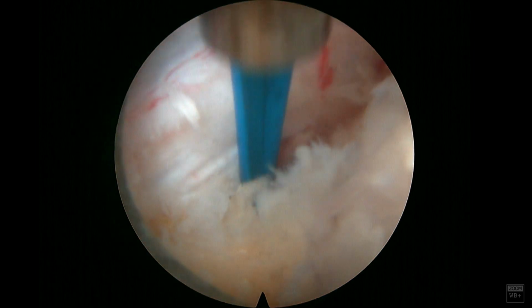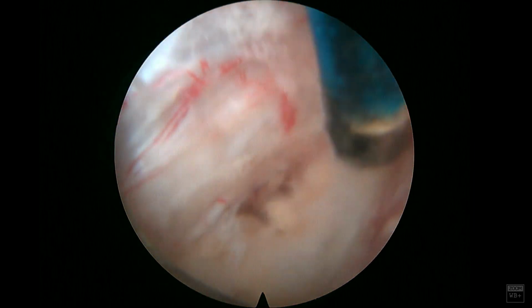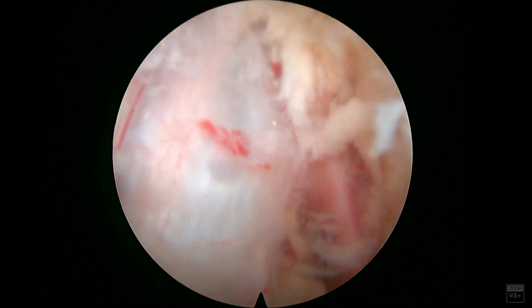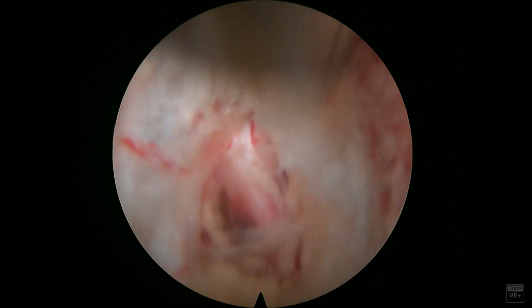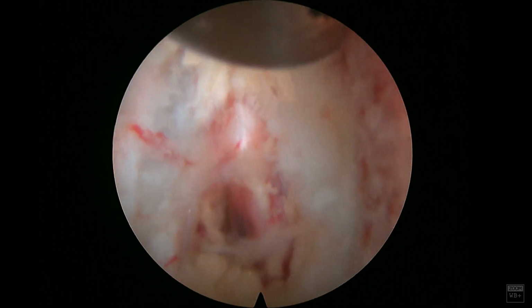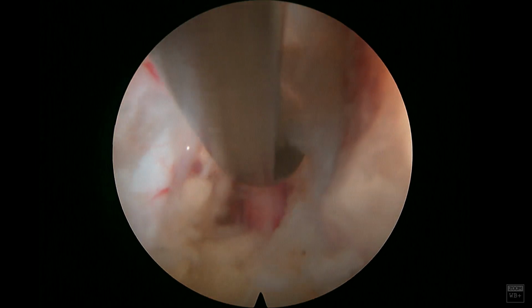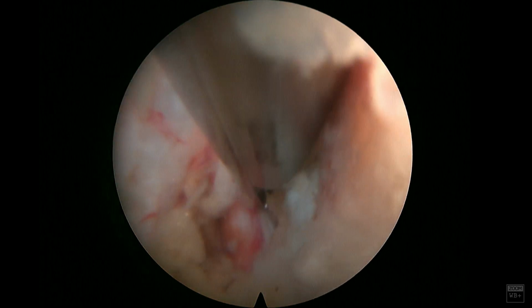that nerve is a little bit erythematous, and you'll see here once I open up the lateral recess a little bit that this really was the culprit of the patient's radiculopathy due to the irritation of the nerve root. So we've gone through and increased the expansion of our lateral recess with Kerrisons, and as you can see here, the cortical area up above is still maintained. Again, I know I keep stressing that I'm only decompressing kind of inside out, right above the traversing nerve root. Again, I'm going to keep stressing that this is important for stabilization of that segment.